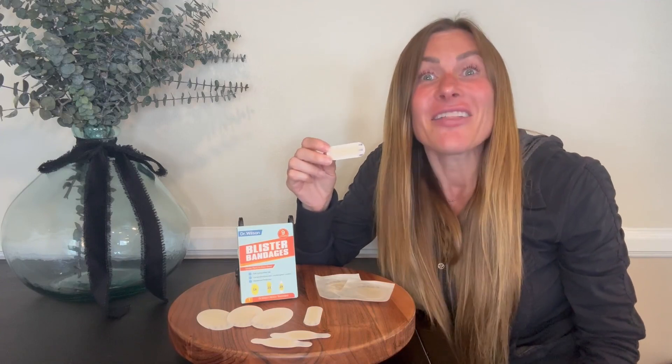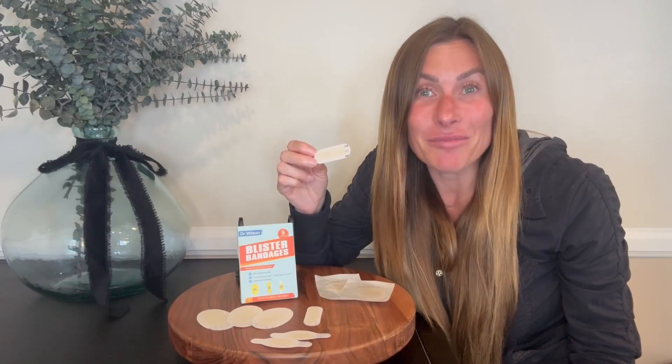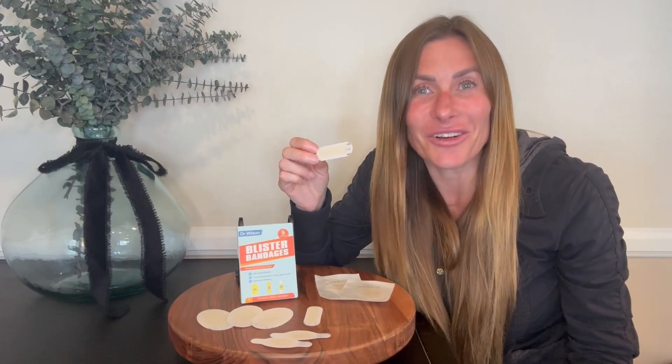I have been so pleased with these bandages. They are absolutely the best thing I have found for protecting my blisters. I hope that this up-close look and information today helps you make your decision.